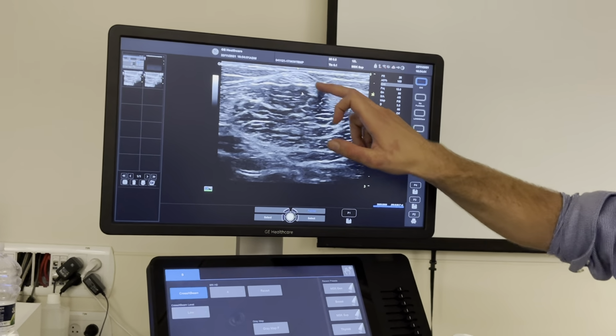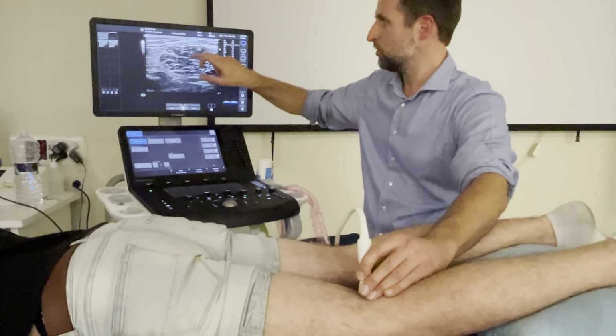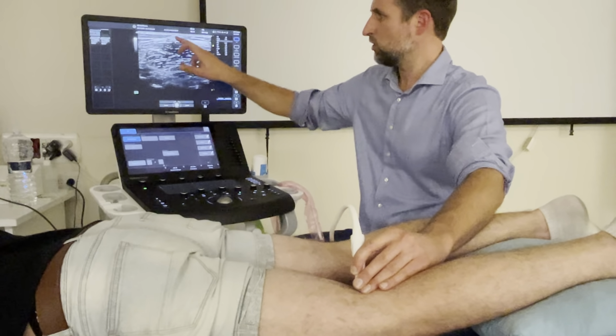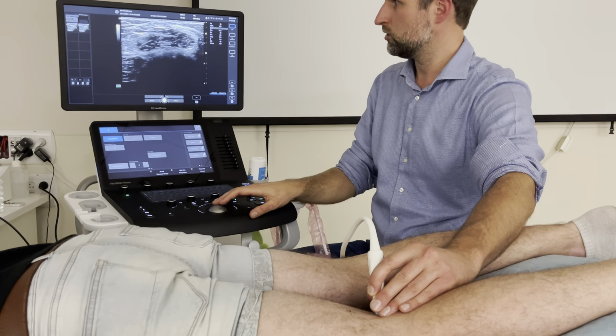And we call this image sometimes the cherry on the cake, because this looks a little bit like a cherry on the cake. We go a little bit more proximal. You will see the myotendinous junction of the semitendinosus with the muscle belly. So the myotendinous junction. If we go, now we have a cake on a cake actually. We go a bit more distal. This cake disappears, and now we have a cherry and we have a big cake. What we do, we put this in the middle of our image. Here we have a nice marker for the middle of our image.